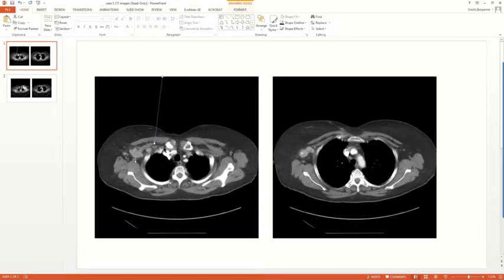You can also see she's got a really big right level 1 axillary lymph node and also this malignant level 2 axillary lymph node. This is a bit lower slice showing these lymph nodes are kind of clumped together. I bet this would qualify as quote unquote matted. Matted is very much subjective and in the eye of the beholder, but I would say these are matted. You'll remember from your staging studying that matted makes you a clinical N2 as opposed to an N1. But this patient was N3C because we did an ultrasound, found a supraclavicular node, and biopsy proved that.